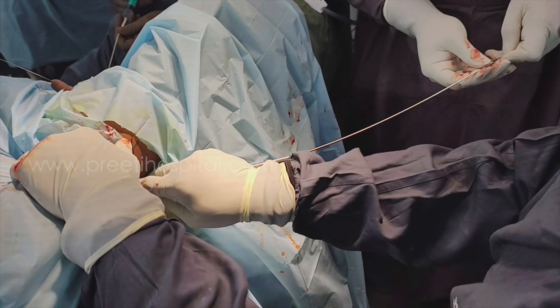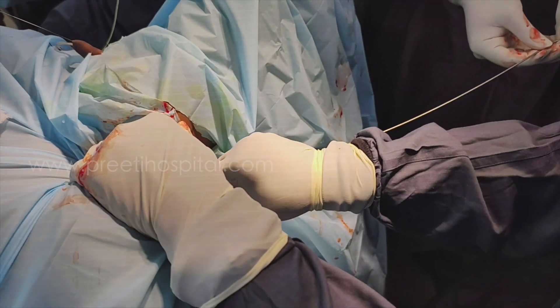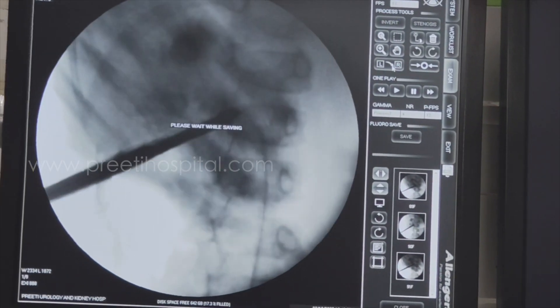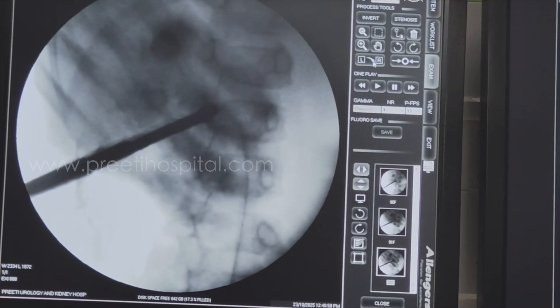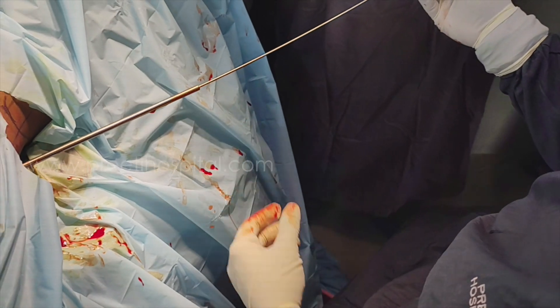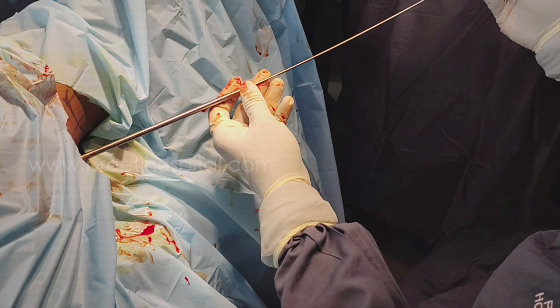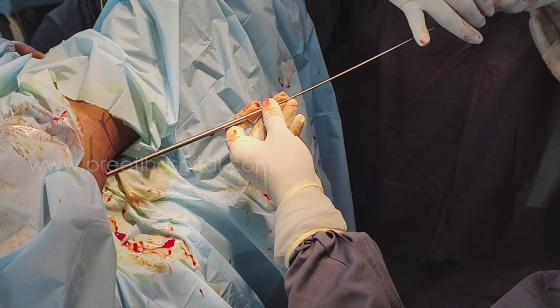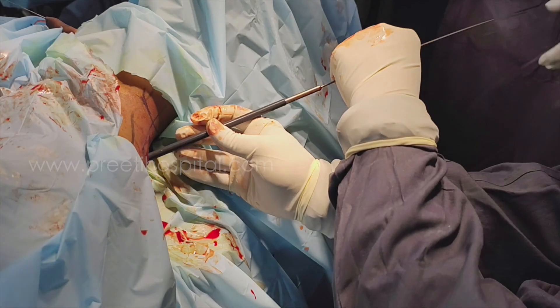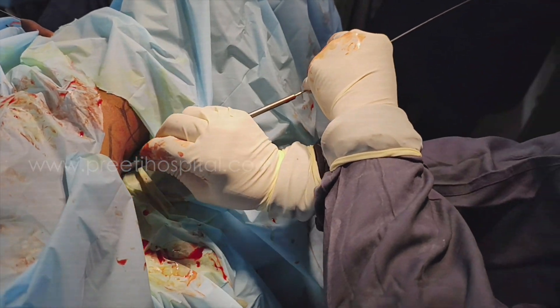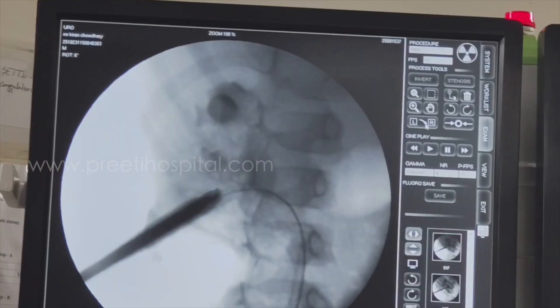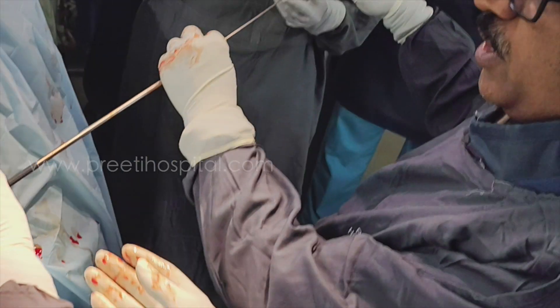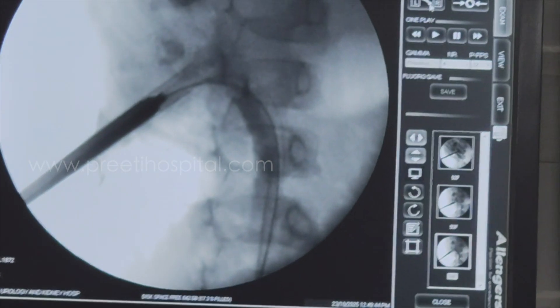Anyway, with a large stone this is dangerous. Last dilator — you have to put saline. I am able to feel the kidney here, not the stone — how will you feel the stone? The stone will also move. Now you will inject saline — there is some bleeding. You should use a lot of saline from below. One of the urologists should scrub — they should not stand outside. Whoever is assisting from below should scrub. Now inject contrast and slowly, slowly go there. Is it there? Yes. No infundibular injury should occur.